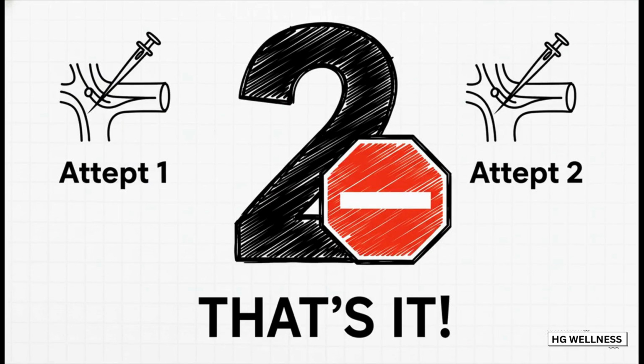This next point is a core principle of professional phlebotomy. It is the 2-attempt rule.